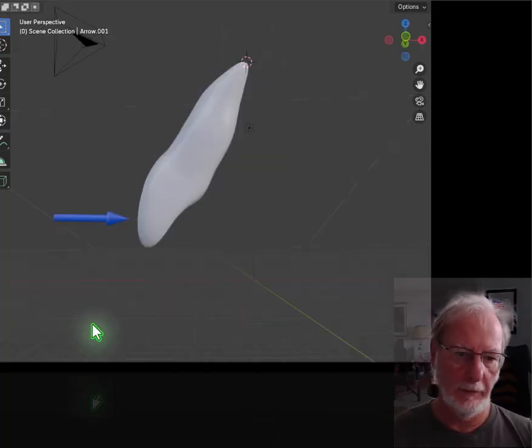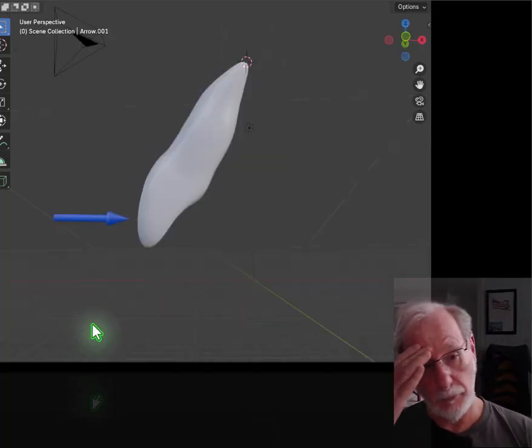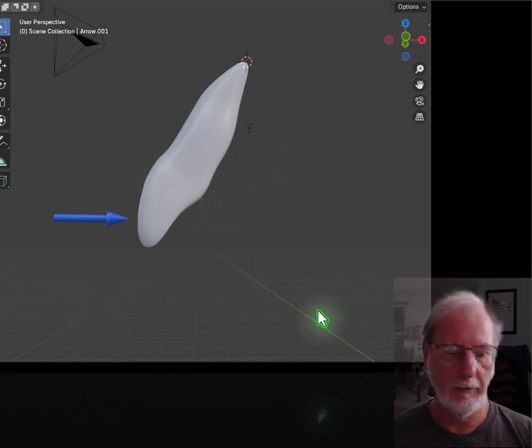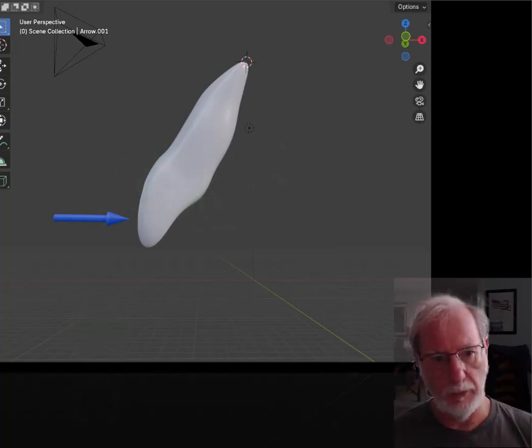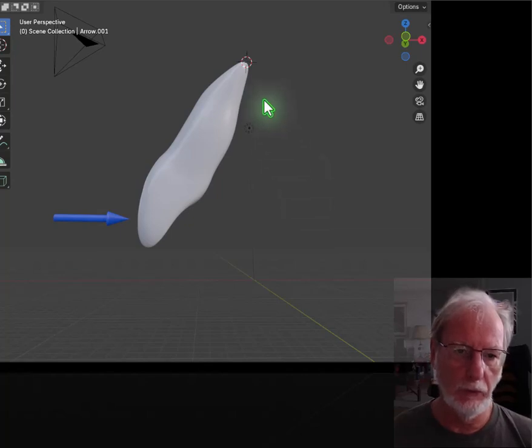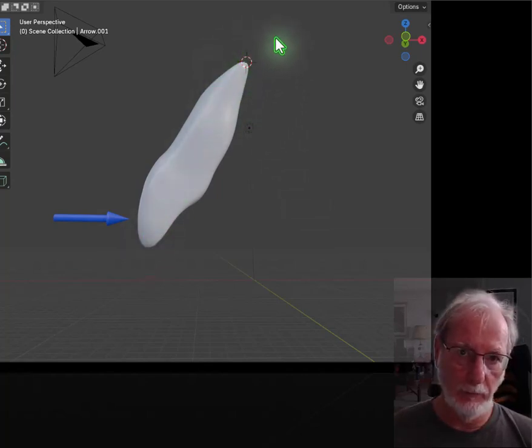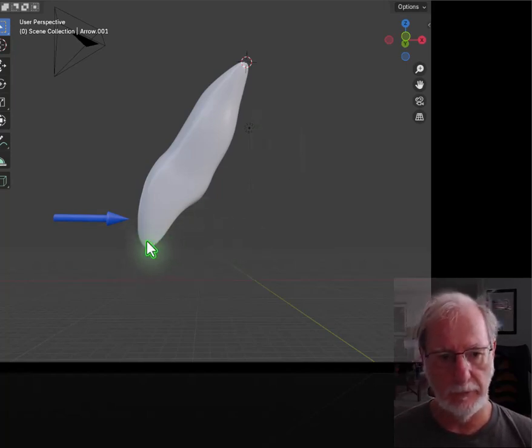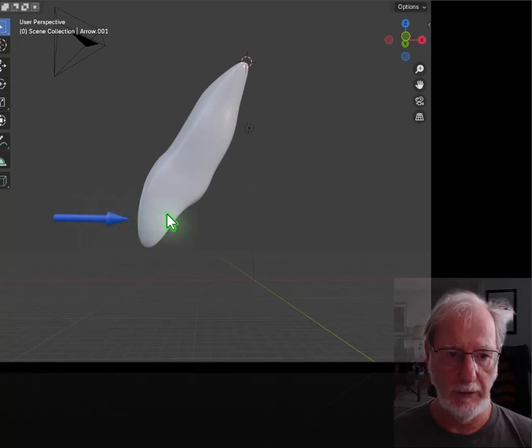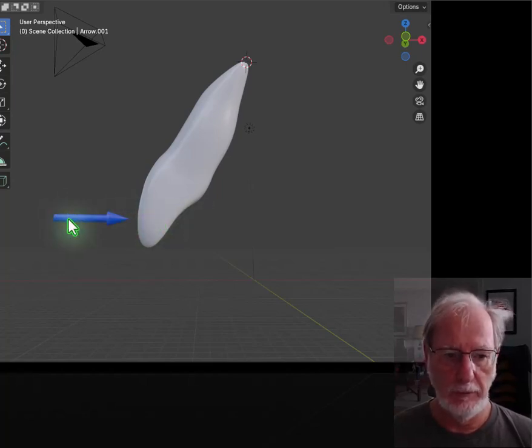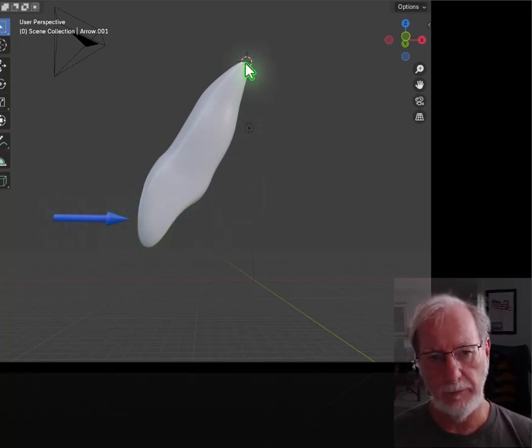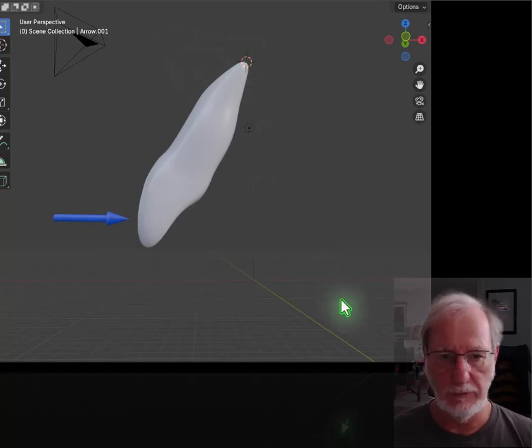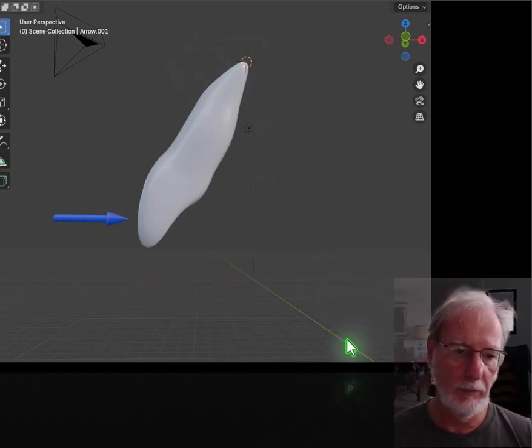Now let's assume that we have a proclined upper incisor with an aligner, but this time we would like what we call control tipping. The tooth will rotate and not move the apex while the crown will come distally. Obviously, if we do just a tipping motion, this will bring the crown distally, but unfortunately the apex will come mesially. So what can we do?